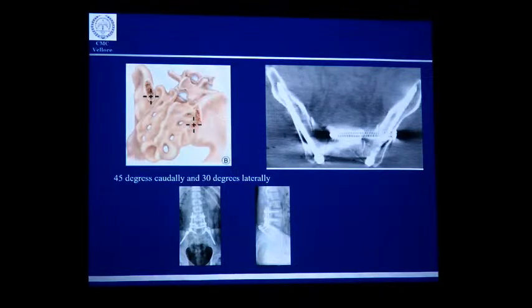Or, if you have not completely disarticulated the sacroiliac joint but need additional support, you can place a sacroiliac screw at the S2 level or S1 level, going across the sacroiliac joint into the iliac bone. So these are the different methods in which we do a lumbopelvic fixation for a patient in whom we have done a sacrectomy.